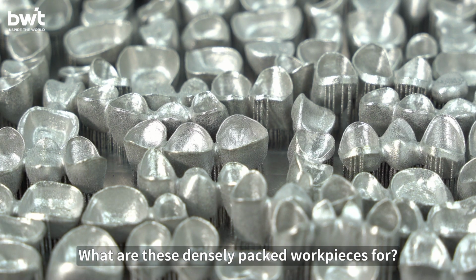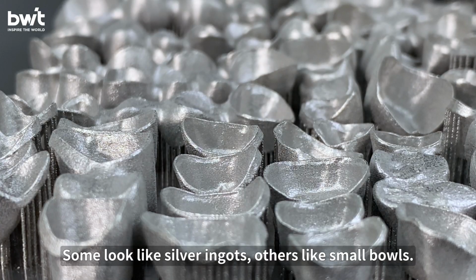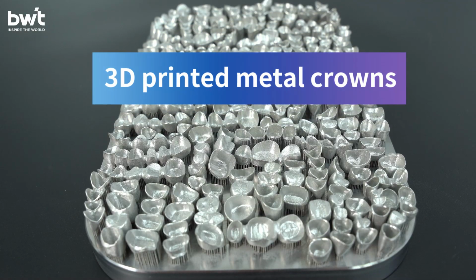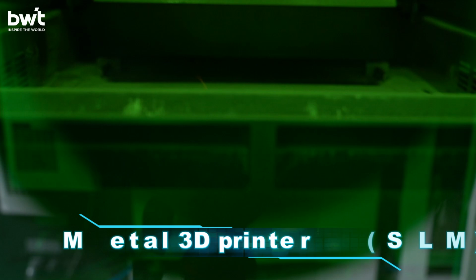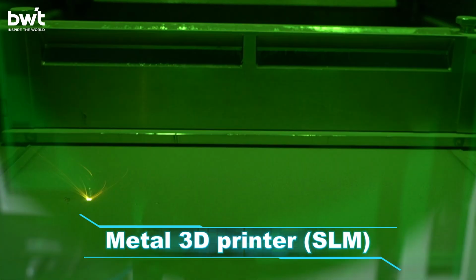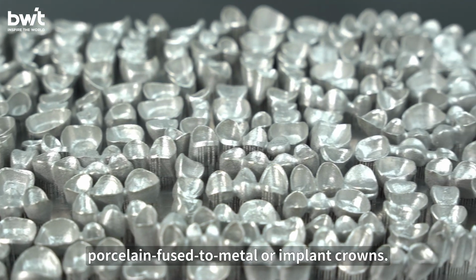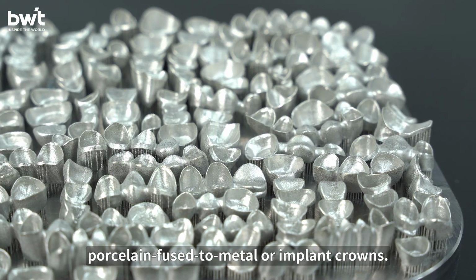What are these densely packed workpieces for? Some look like silver ingots, others like small bowls. In fact, these are 3D metal dental crowns produced using a metal sintering 3D printer, SLM. After processing, 3D printed metal crowns become porcelain fused to metal or implant crowns.